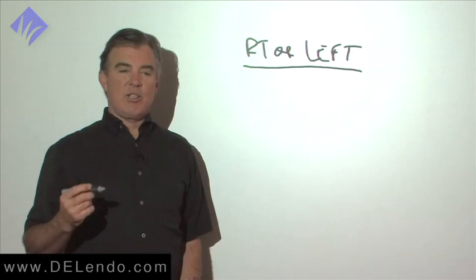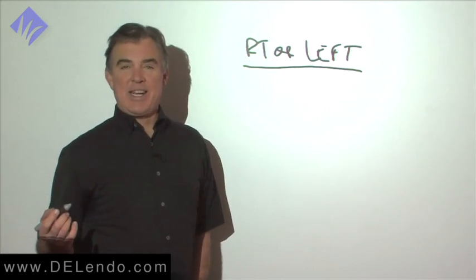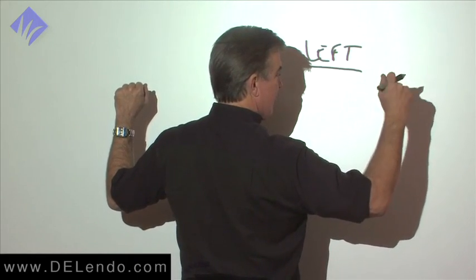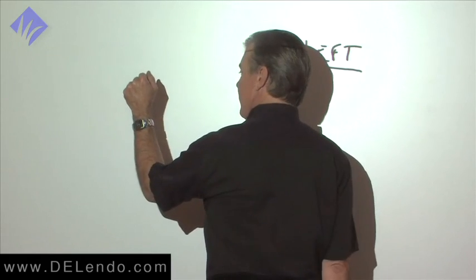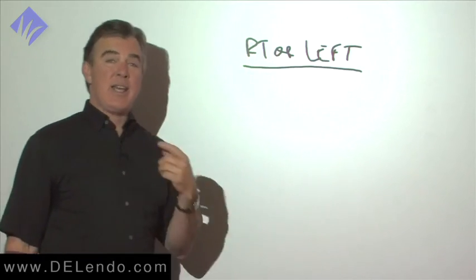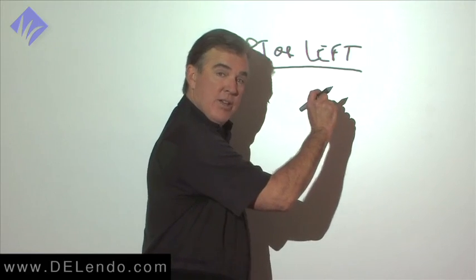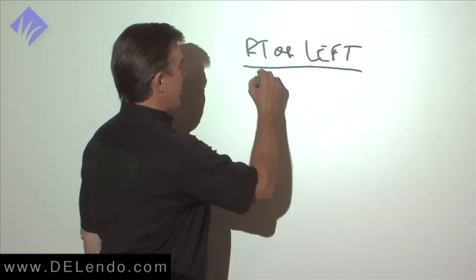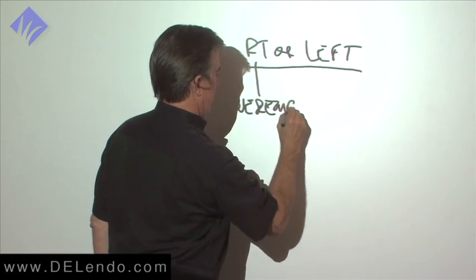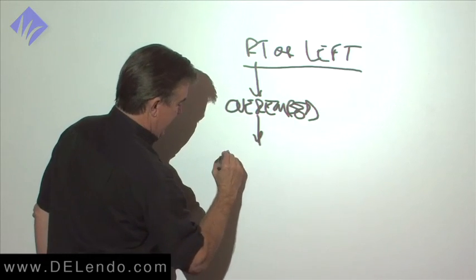As we looked at this and tried to deconstruct what's going on here, it's another example of the anatomic imperative. Right-handers have their power stroke this way, clockwise. Left-handers have their power stroke counterclockwise. Which way are we turning the file to cut? Counterclockwise. Which way do we want to avoid over-engaging the file? Unfortunately, in the direction of right-handers' power strokes. So right-handers tend to over-embed the file, and they tend to not make the cut, so to speak.